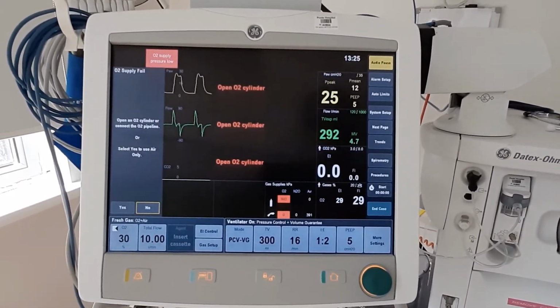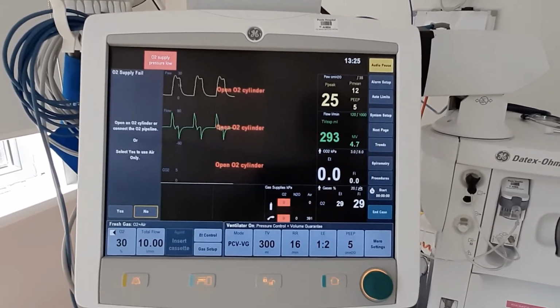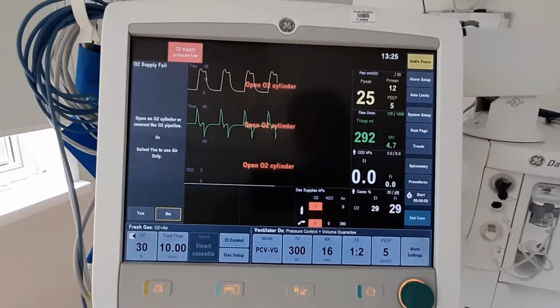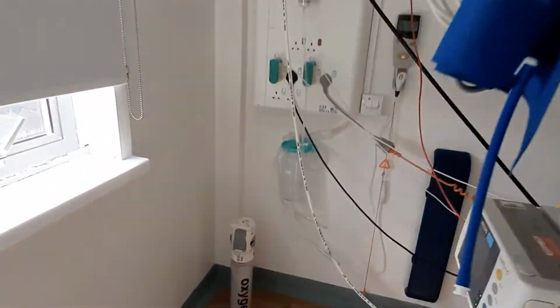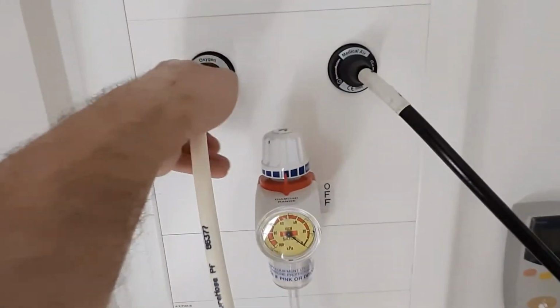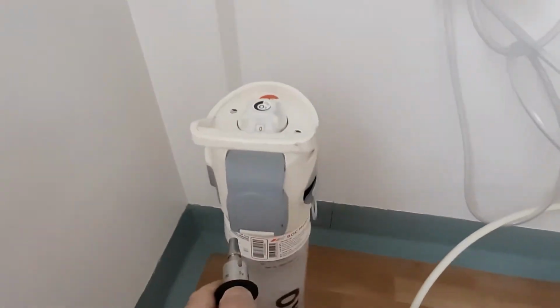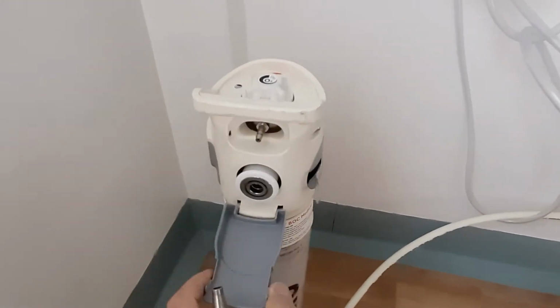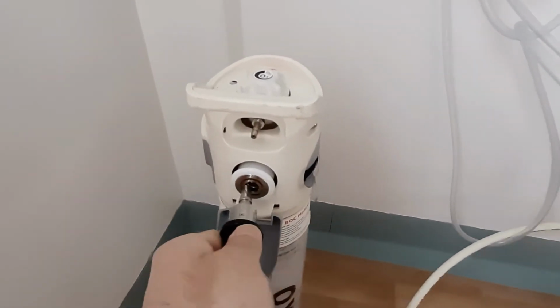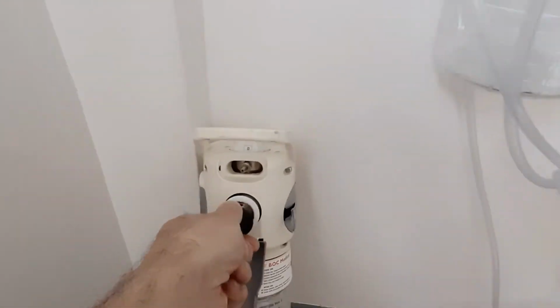If the spare cylinder on the back of the anaesthetic machine is empty, or not working, or not available, then we need to use our spare CD cylinder. In order to access this, disconnect the mains pipe from the main socket and insert it into the Schrader valve of the CD cylinder. Also, do not forget to turn it on with a black wheel on the right hand side.